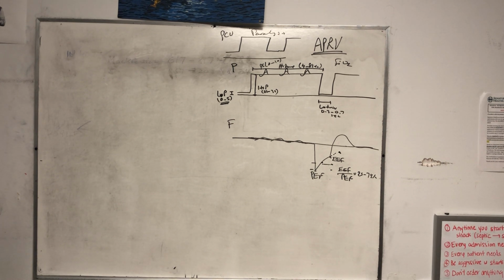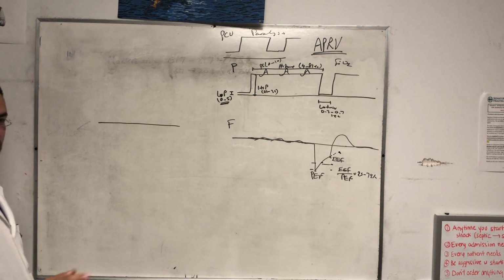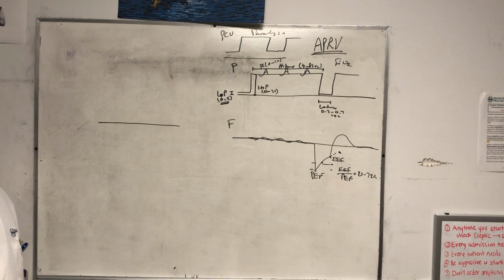So let me ask you this. Let's say we do this every 2 hours, and we ask the respiratory therapist to, I mean, we don't ask the respiratory therapist every 2 hours. We ask the residents, when they go around, if you see a patient with classic APRV, this is not the one that we order every day, it's bi-level, right? So classic APRV, you have to do that ratio. And the nurses, if they can, do that ratio. You're not changing the vent, you're just freezing and measuring. You're not changing the settings when you do it.